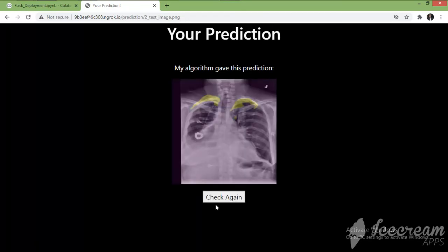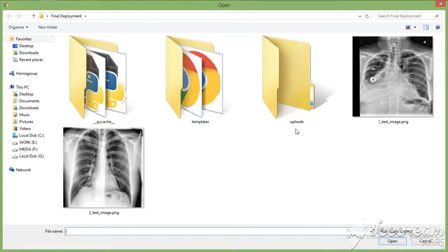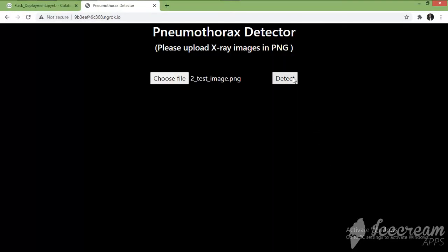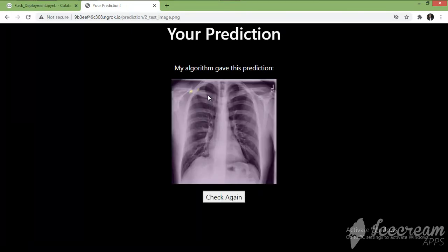I will use this second image and click on Detect. Similar to the previous image, we can see that the model says there is a very small pneumothorax, or maybe this patient is safe. We can say that this patient does not need to go under treatment. This is how our model is predicting the mask for X-rays.